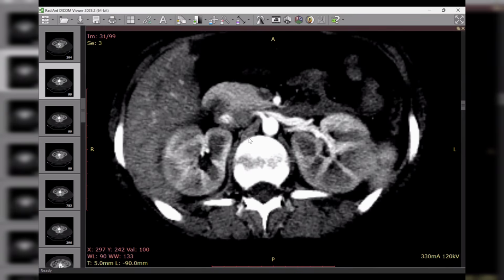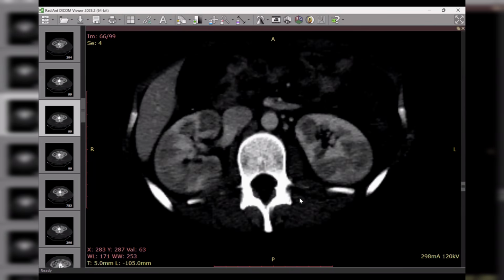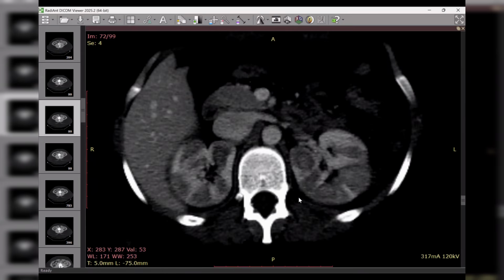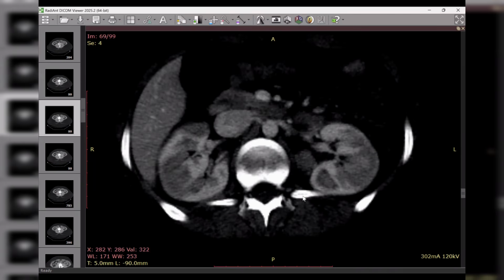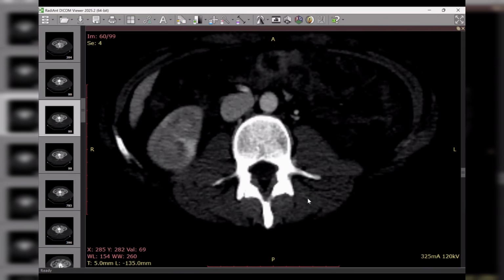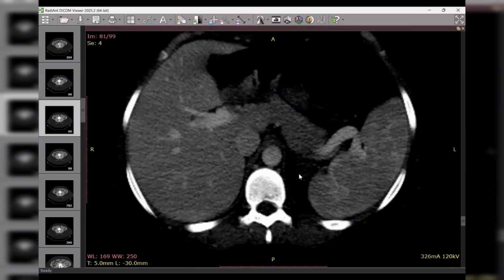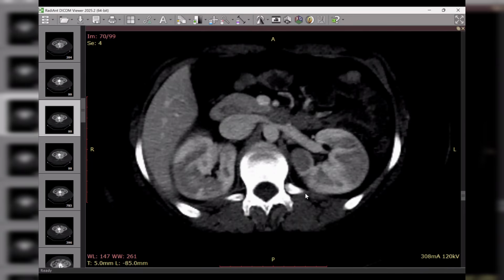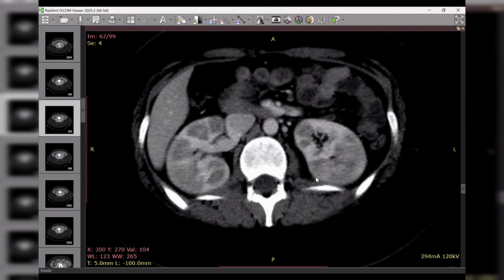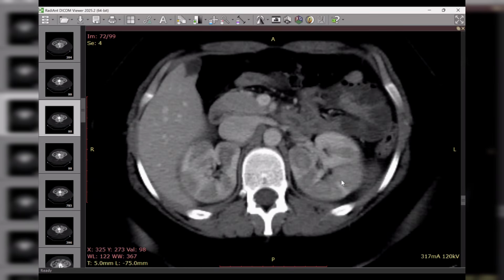Just give me a second, okay? Let me show you another phase of this study. What do you think right now? There is a patchy enhancement of the left kidney noted. Rather, only the left kidney or bilateral kidneys? Excellent, go ahead. So the changes are, yes, bilateral patchy enhancement is seen in the kidneys bilaterally, and there are some air loculi suspected. No air loculi. Okay, so I'm looking for any perinephric fat stranding. There is no perinephric fat stranding seen. Excellent. You're doing very well, actually.